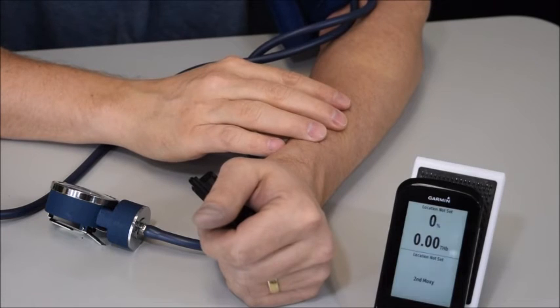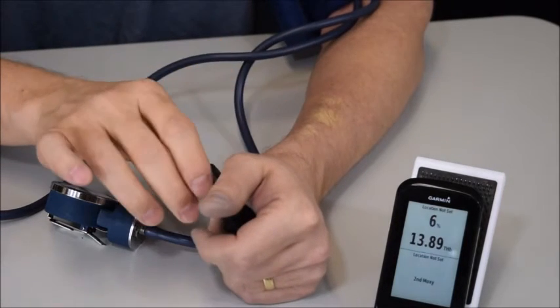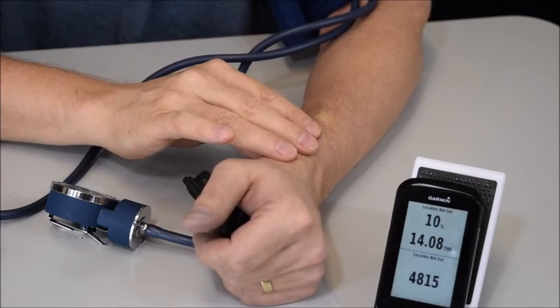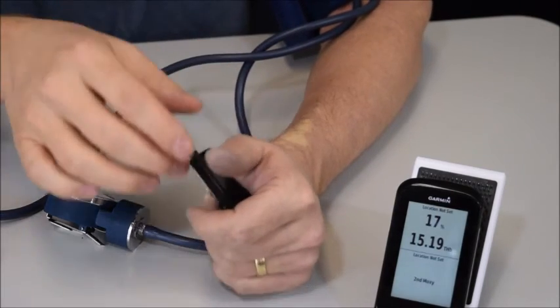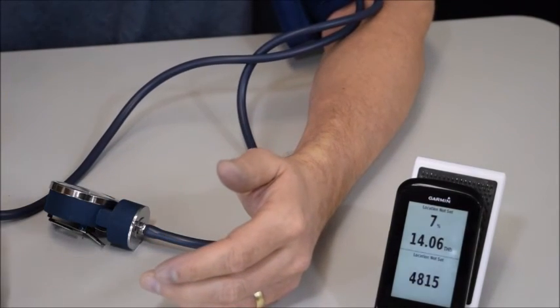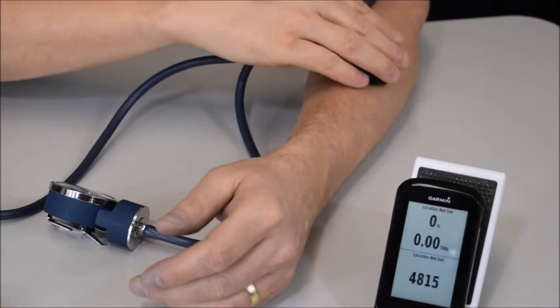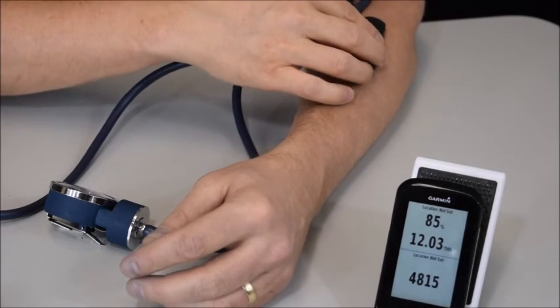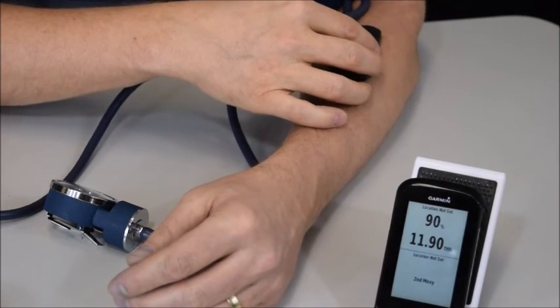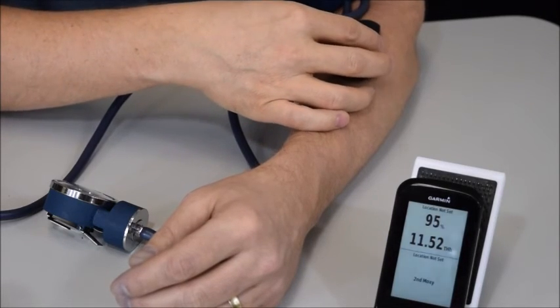And let's see, 6 or so, 6 or 10 on the forearm. So it's getting really close to 0, just bouncing very close to 0, which again is what we would expect in this situation. And now I'm going to get this device reading again. We're also going to release the cuff here because I'm getting kind of tired of having it on, and we're just going to show what happens when we release this cuff.